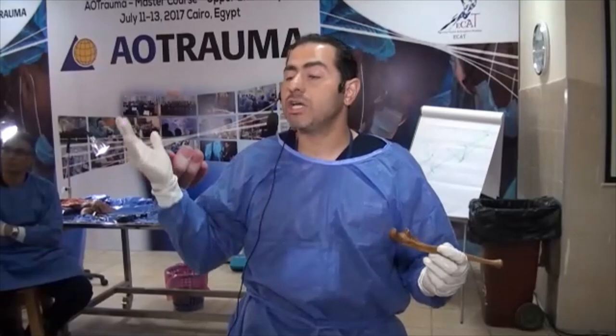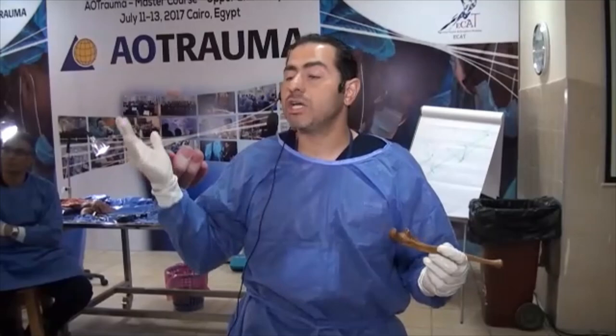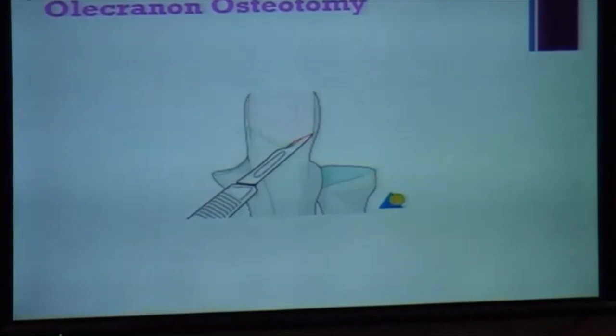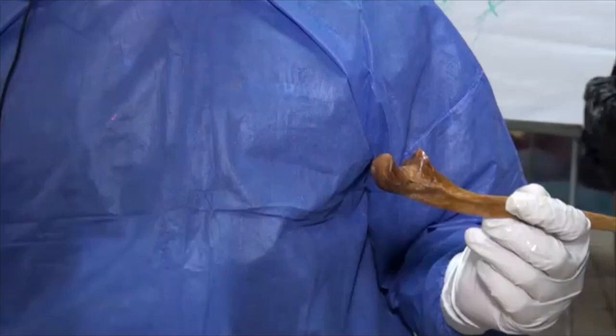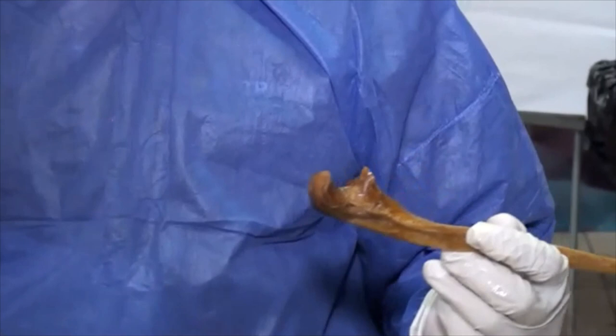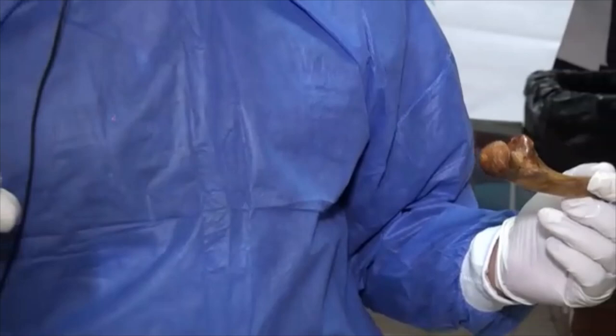We prefer to do a chevron osteotomy because it increases the surface area for bone healing and also provides a little more rotational stability when you do the reduction of the olecranon.